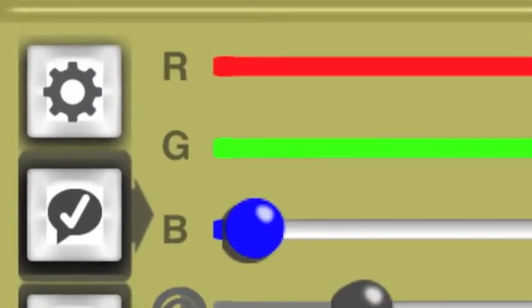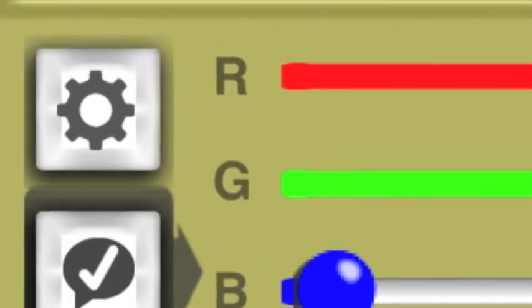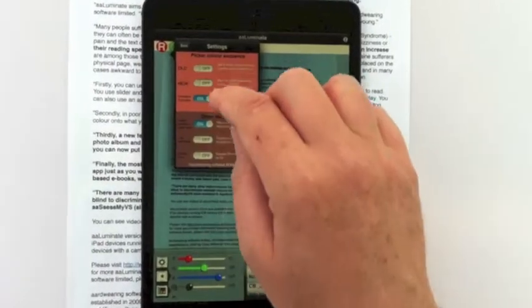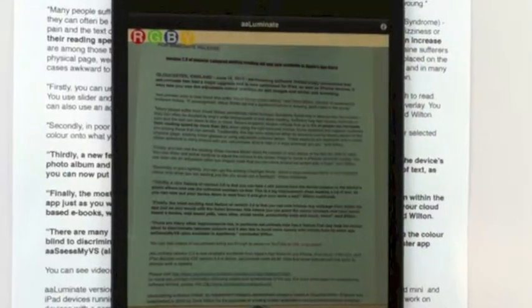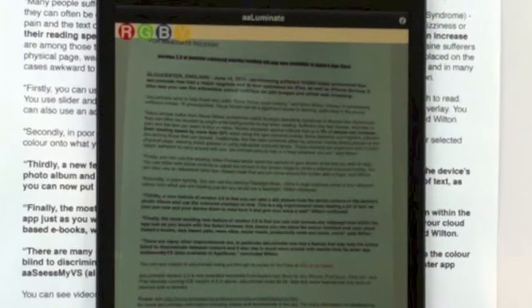To change the sequence to the one you want, press this button on the main screen to call up the settings screen, then simply set the switch for that sequence to on, and the previous one in use turns off automatically. The remaining settings on the settings screen.